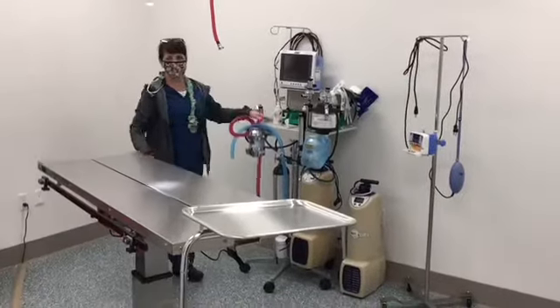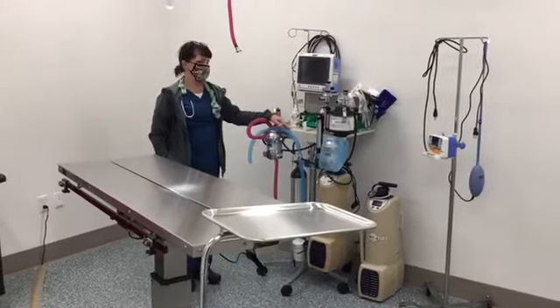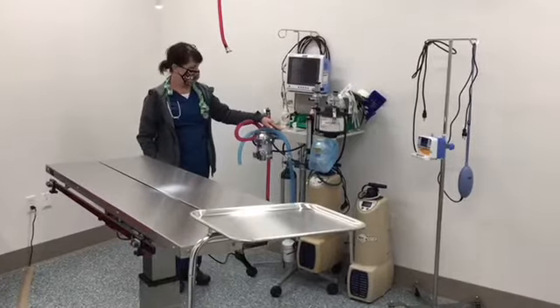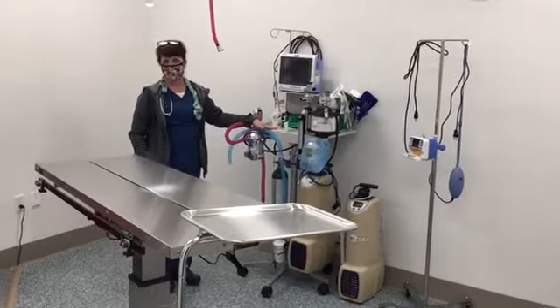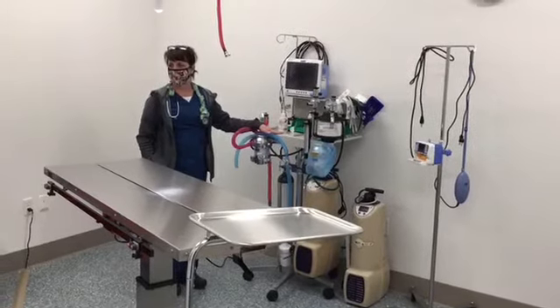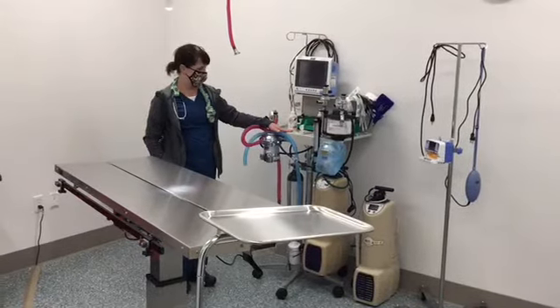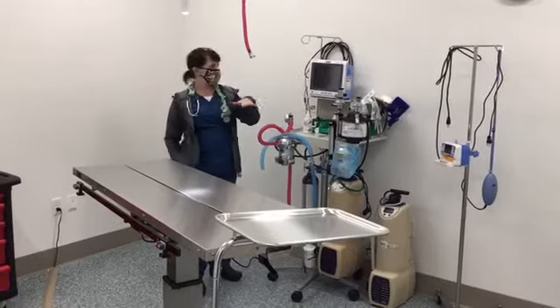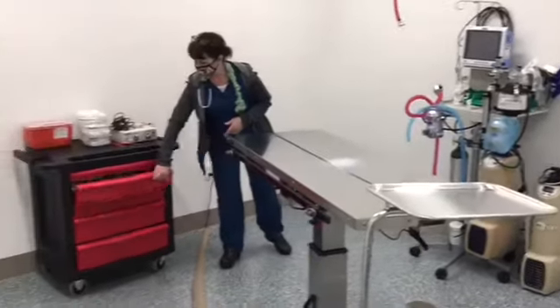The anesthesia machine keeps the animals sleeping so that we can do surgeries and they don't feel anything while surgery is being performed. We do spays and neuters. We also can do other surgeries that our patients might need. But again, this is our surgery room where there is some equipment here that we use.